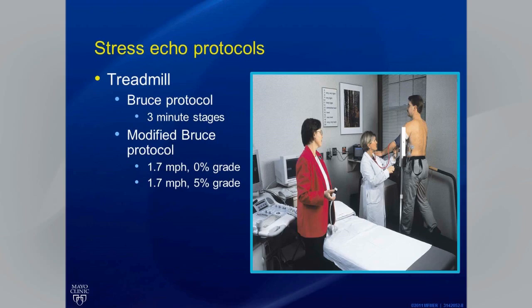Note the setup to our stress echo laboratory. The treadmill and echo bed are very close in proximity, and this is important so that there's no delay in getting the patient from the treadmill to the echo bed.